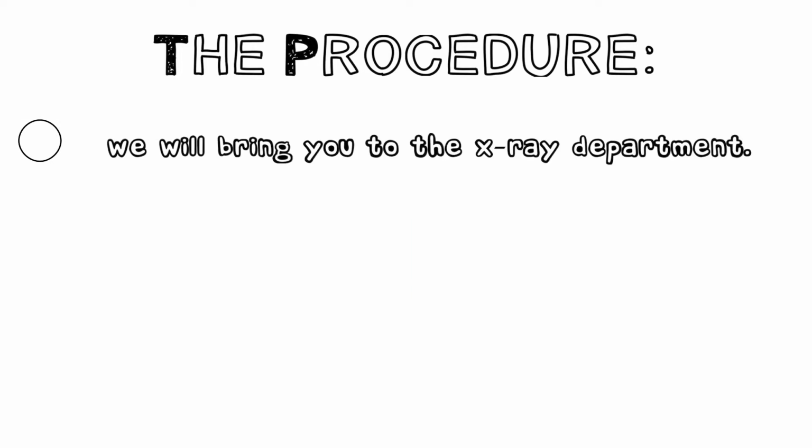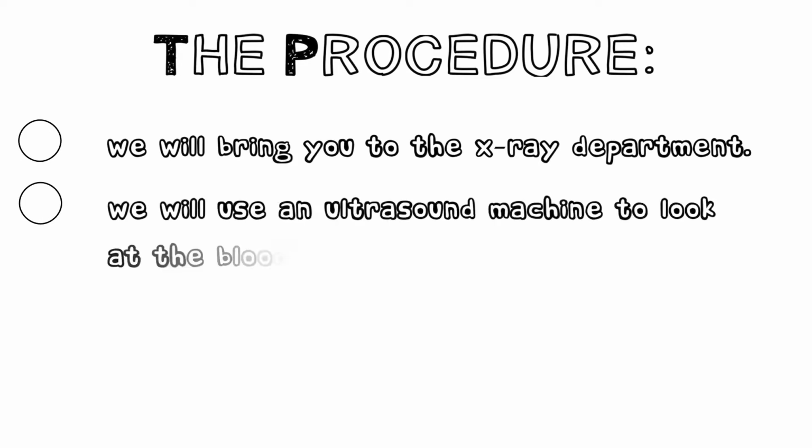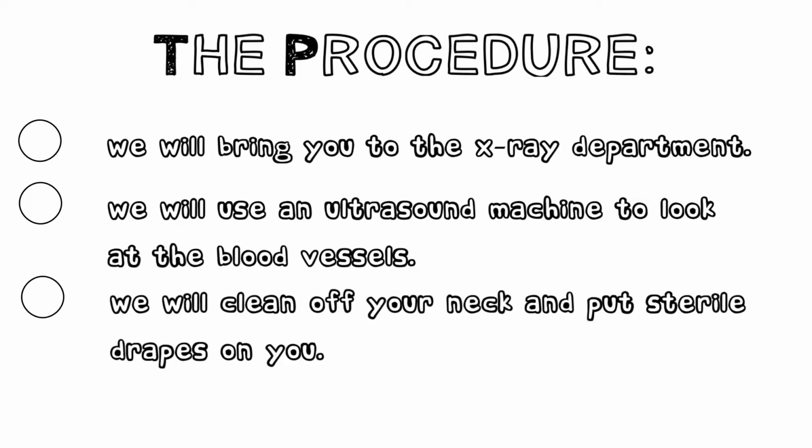So the way this procedure works is we'll have you come to the department. We'll place you very comfortably on your back on an x-ray table. We'll use an ultrasound machine to look at the blood vessels in your neck so that we can pick the best vessel to try to go through. Once we find the perfect vessel to put the piece of plastic tubing in, we'll clean off your neck, and then we'll put some drapes over you that are sterile.